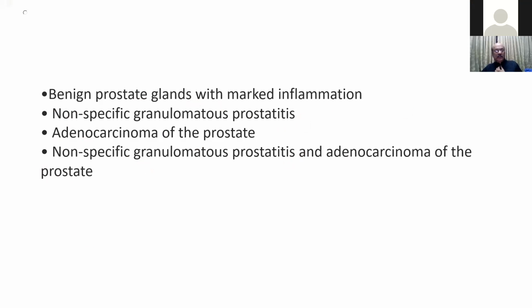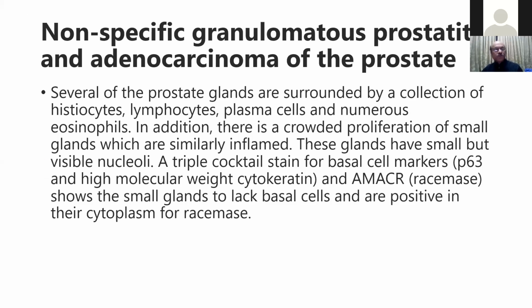So these four are choices. Among these four, the diagnosis is the last one, non-specific granulomatous prostatitis and adenocarcinoma of the prostate.